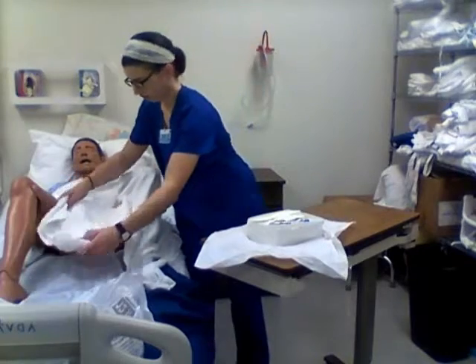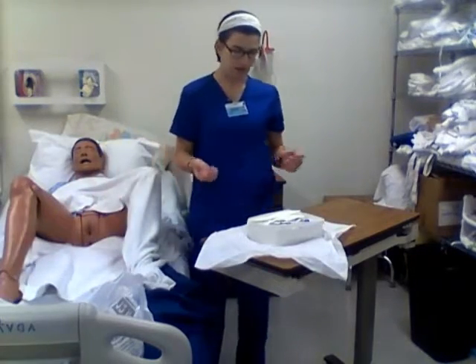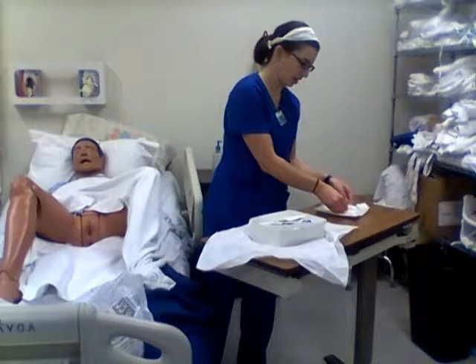All right. And so we're going to go ahead, we can remove our gloves without touching anything in the packaging.